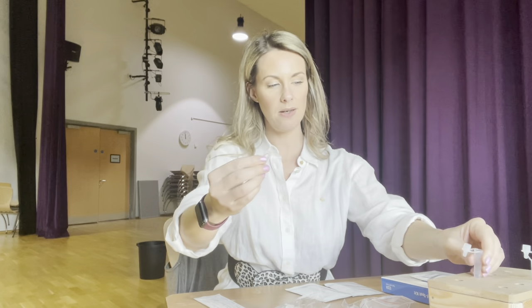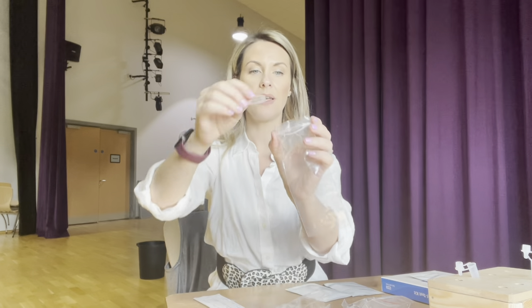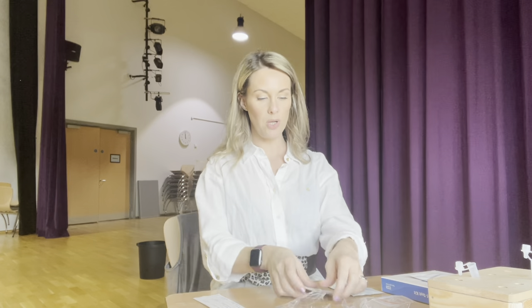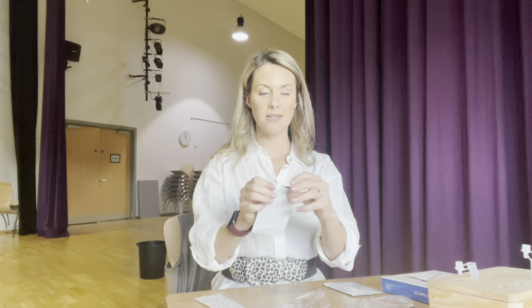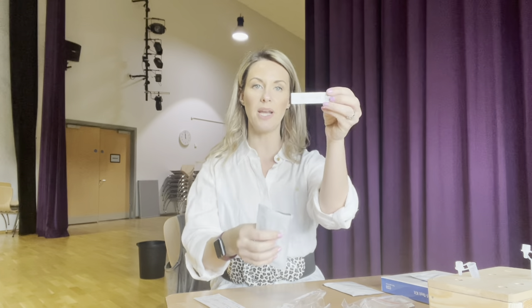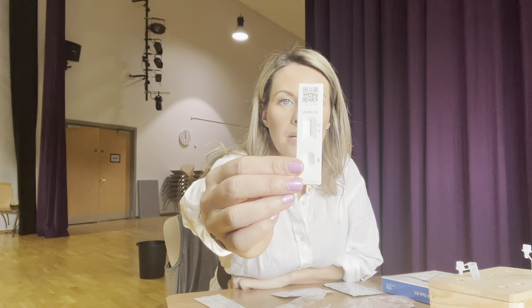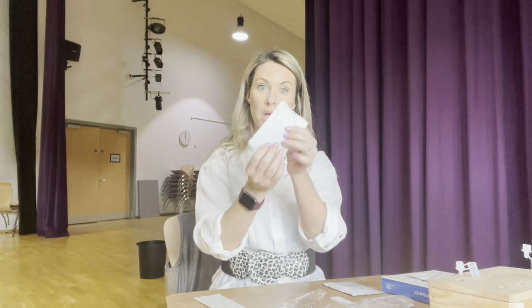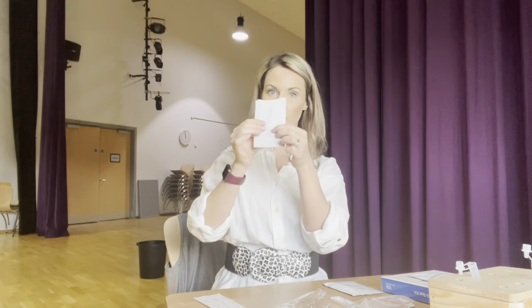Once everything's in, you're going to dispose of the sachet in the plastic bag. The next thing I'm going to do is take the test out of the sachet and place it to one side — this is what the test looks like — and dispose of the bag in a bin.